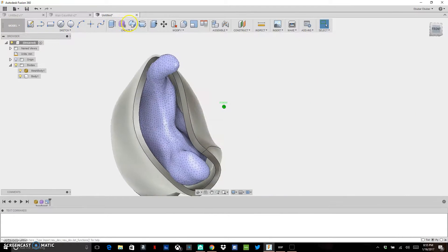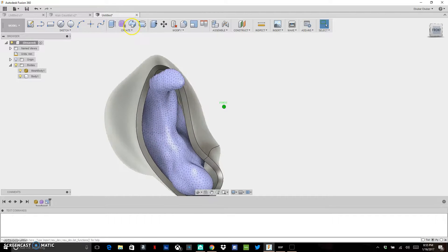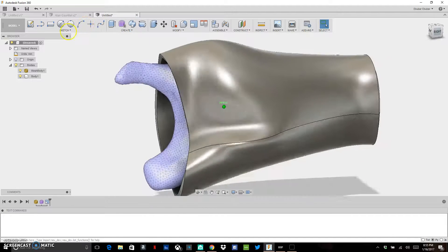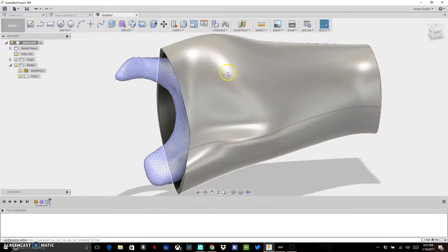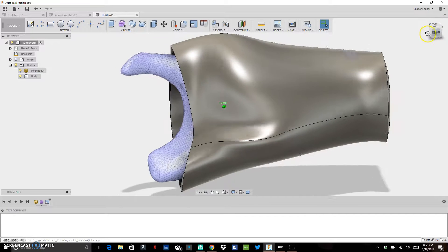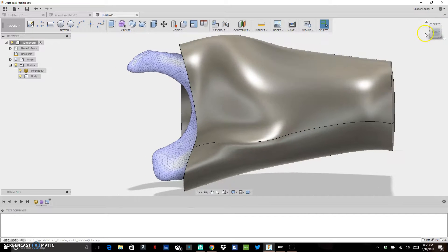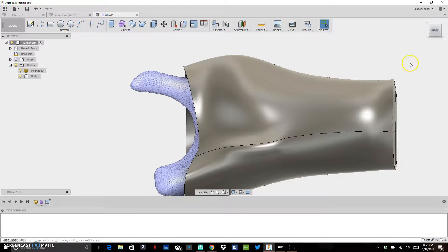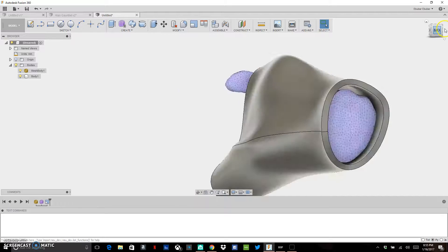In future videos, we'll talk about how to actually attach some fingers, model some fingers onto here, and other things you can do to make this an actual functional partial prosthetic.